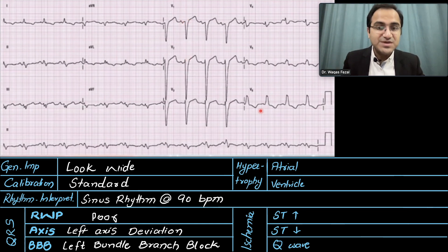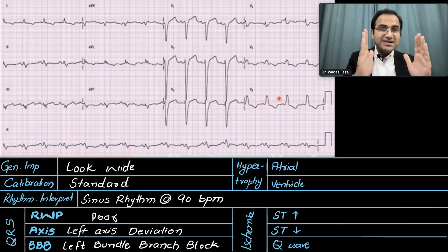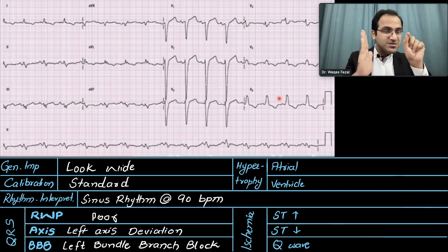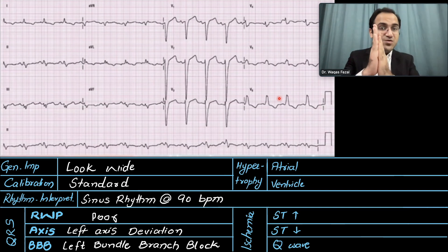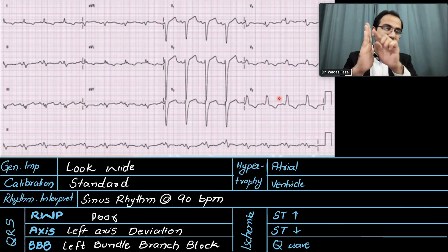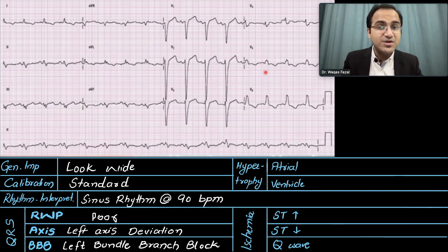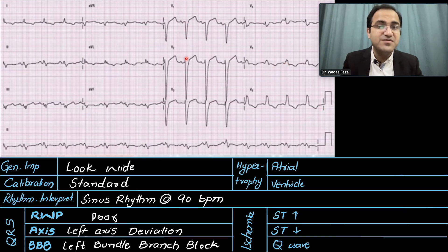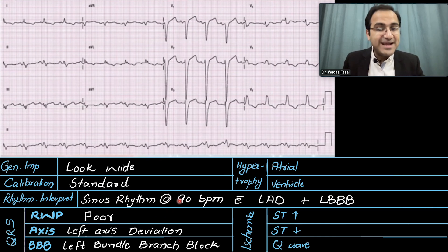Looking at bundle branch blocks: we have an M wave, though it is not very prominent in V6 — sometimes there is just a small notch on the QRS complex indicating it is a combination of two QRS complexes. This can be confirmed by looking at other leads. There is also slurring of the S wave in V1, V2, and V3. So there is left bundle branch block. The final rhythm interpretation: sinus rhythm at 90 beats per minute with left axis deviation and left bundle branch block.